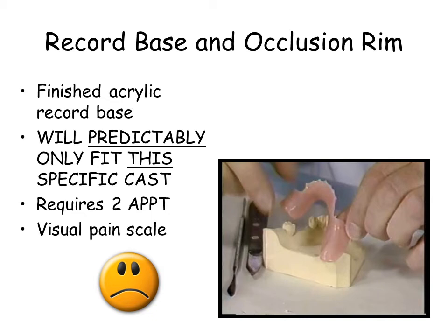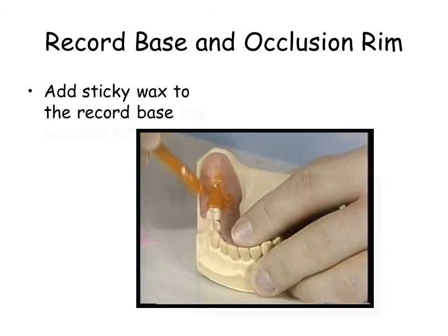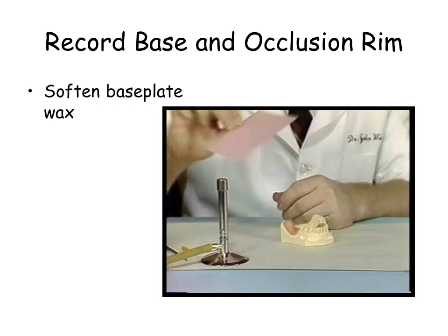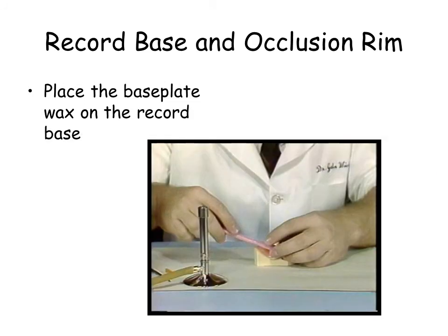After completion of the record base, add pink base plate wax to simulate the occlusal table. First add sticky wax to the surface of the record base. Warm and fold a sheet of base plate wax. Place pink wax on the edentulous areas. The pink base plate wax simulates the occlusal table in height, width and length.